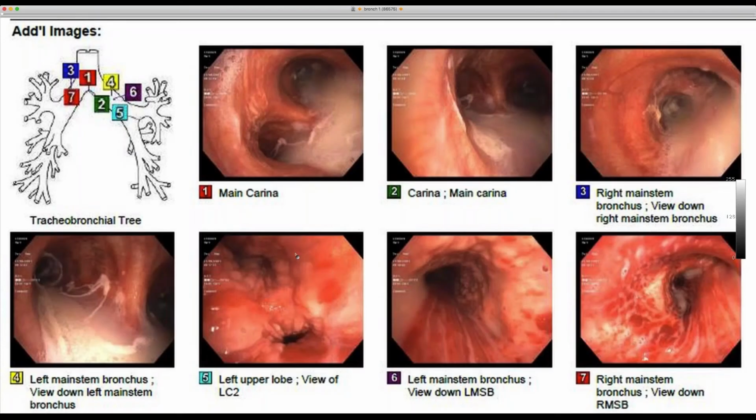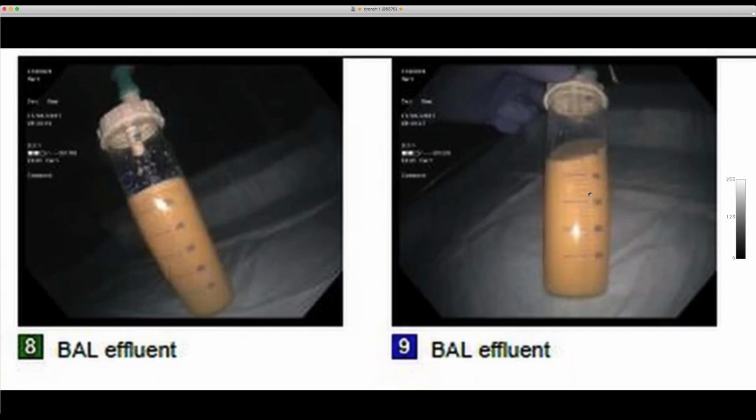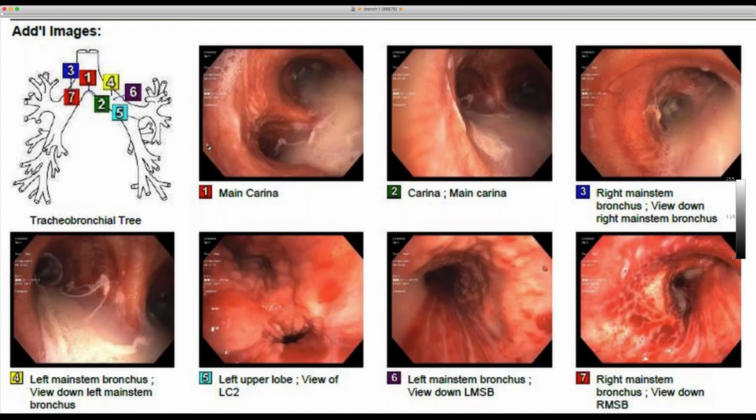So this is the bronch, and you can see he's got this white liquid all throughout the airways. And it's kind of got this nodularity. And this is all the fluid that came from the BAL. Because he was sent to us with a diagnosis of alveolar proteinosis, which I didn't like, and I don't think any of us liked. And when I shared it with some of you, you guys had agreed that it didn't look like alveolar proteinosis, and it shouldn't clear up like that up there, right? So it's like the exact opposite.